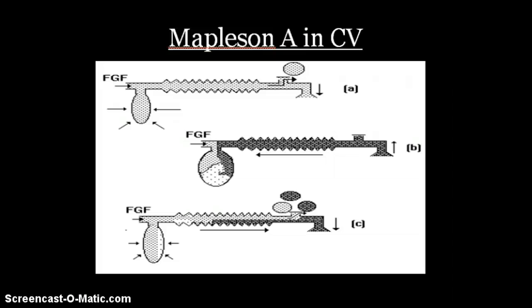The fresh gas port was shifted near the patient in the Mapleson B and C systems in an attempt to reduce rebreathing alveolar gas and improve the utilization of fresh gas during controlled ventilation. This position allows for complete mixing of the two gases, but makes it efficient in neither spontaneous nor controlled ventilation.